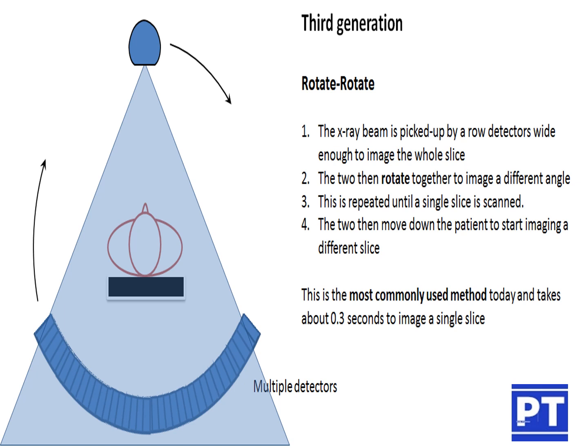Once an image is acquired, the table moves to the next slice position, and the tube detector rotates in the anti-clockwise direction. One clockwise rotation acquires one slice, then the tube detector system rotates anti-clockwise and another slice is acquired. Likewise, clockwise and anti-clockwise rotation happens in the third generation or conventional CT.